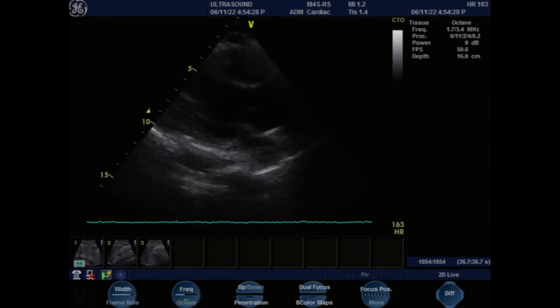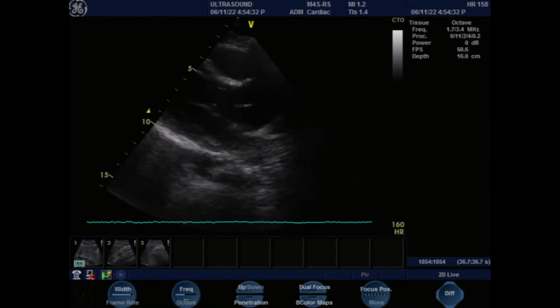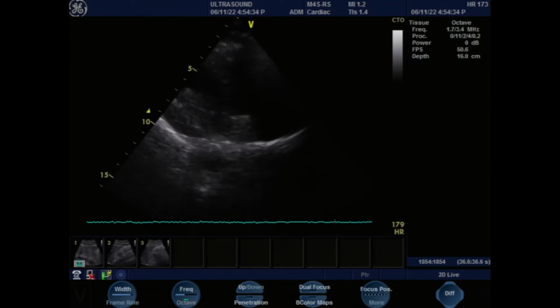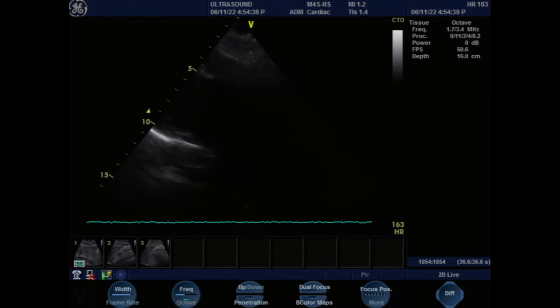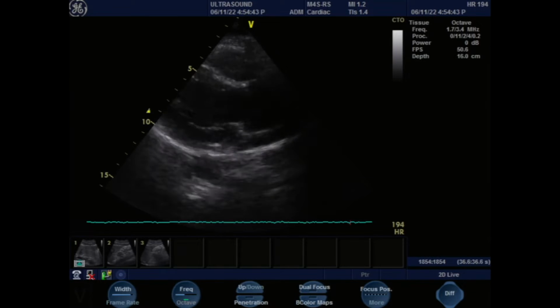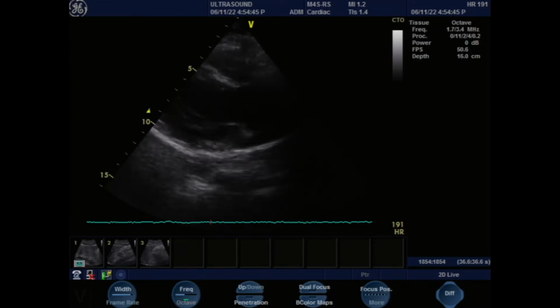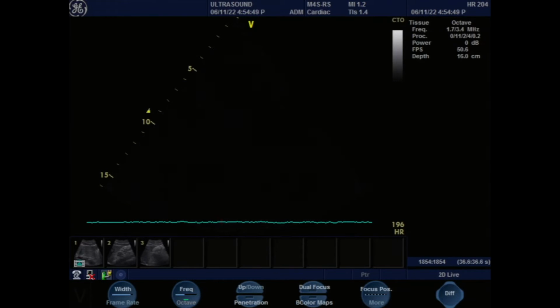So, I think for some reason I can't get his aortic valve. We see it, but I can't see a nice crisp image of the aortic valve. I can see the Mercedes-Benz sign, and somewhere I would see it over there. So I'm going to move on. So the parasternal views, again, give you an idea of what the heart looks like. Now we're going to move to apical views.